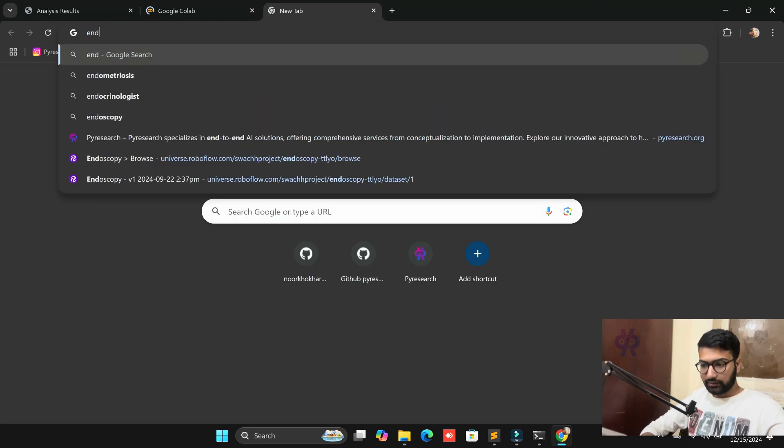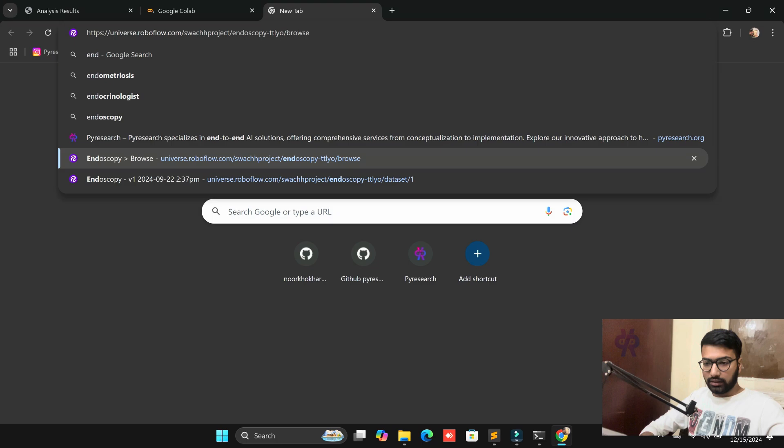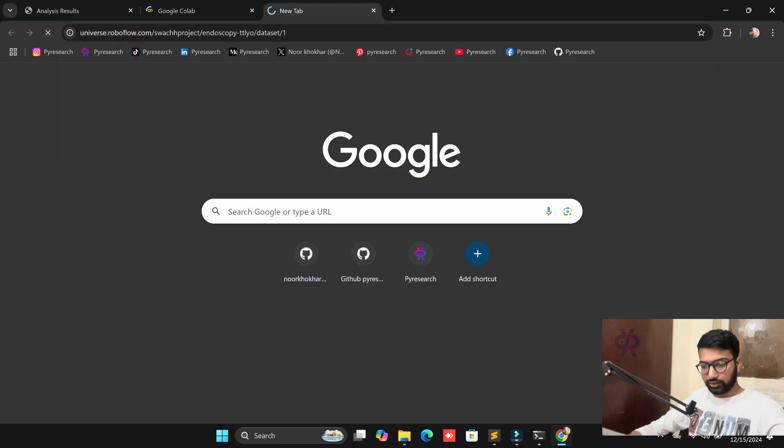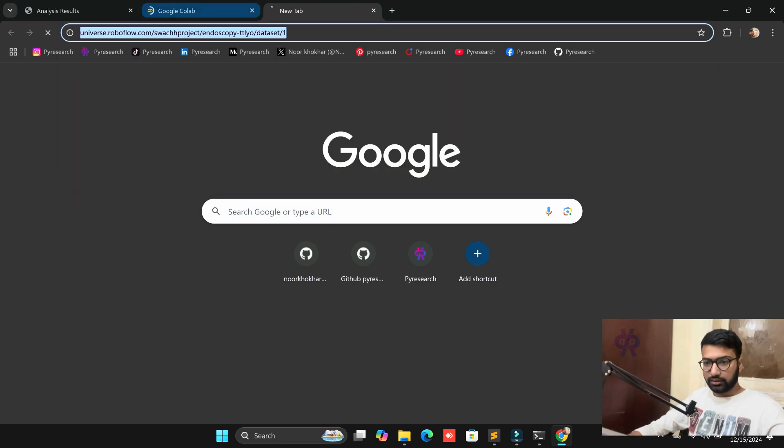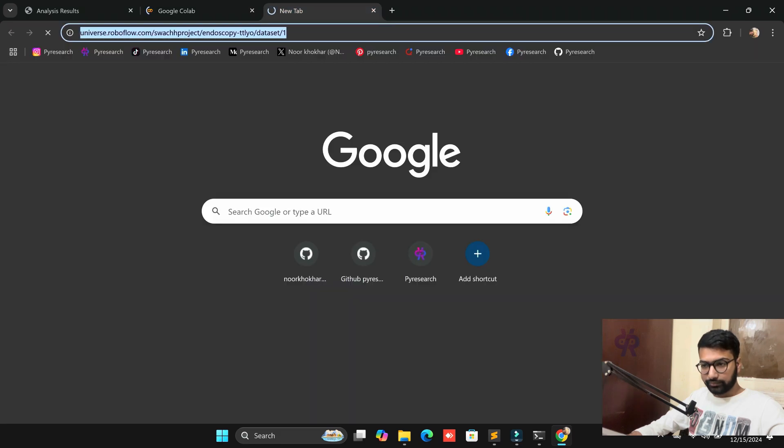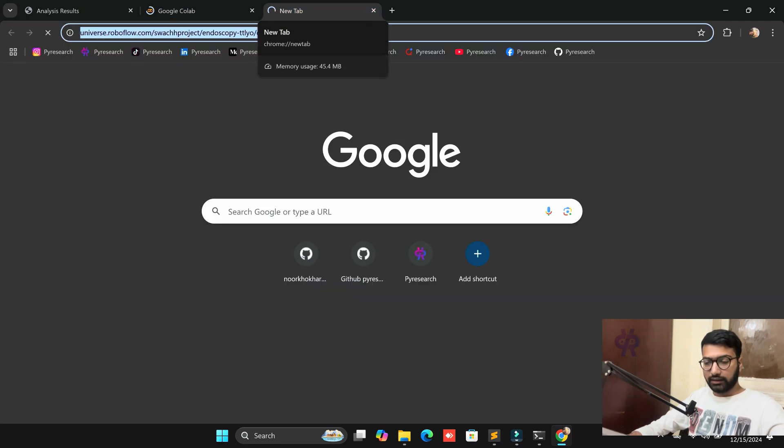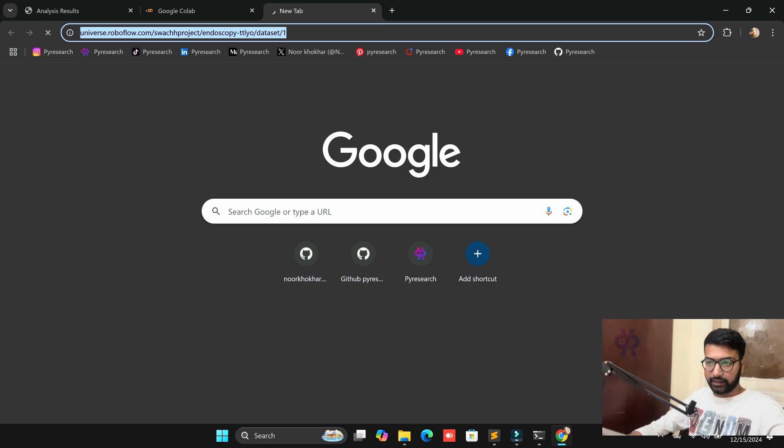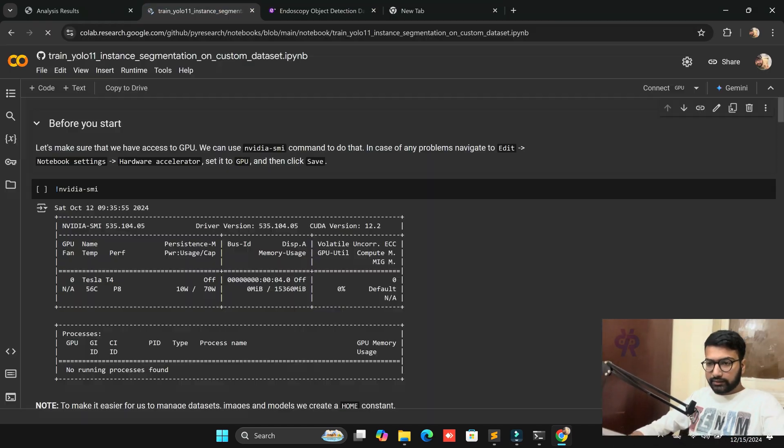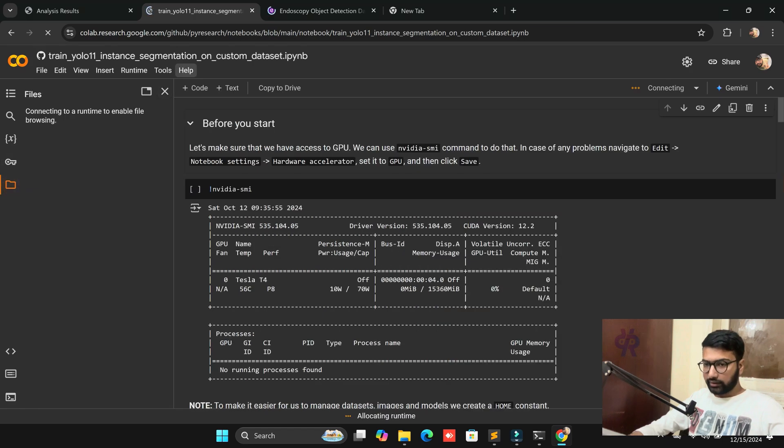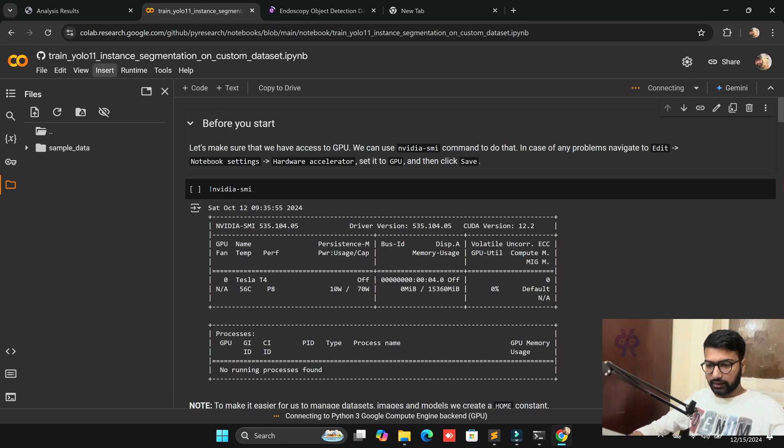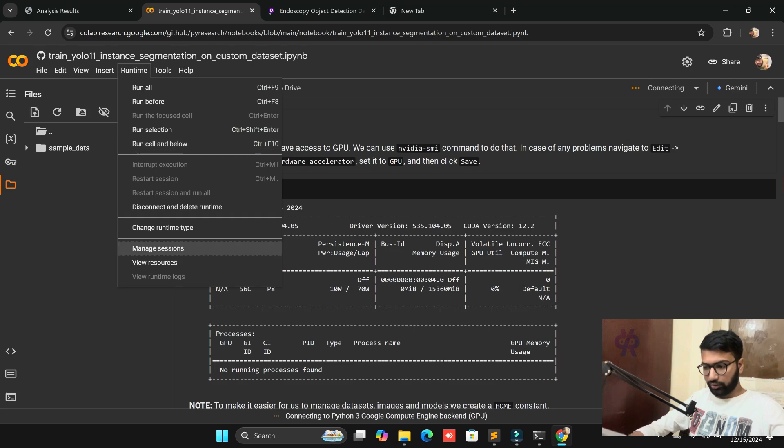Now, how to get from Roboflow custom dataset? I have this link. If you want this link, you'll find it in the YouTube description site. Just open the Google Colab from our PI Research platform, not from notebooks.